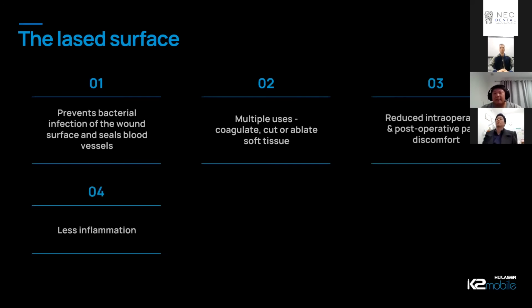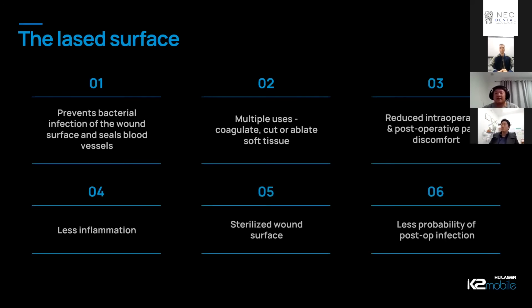So obviously the lasers, like I said, are becoming more popular because of various different reasons. But basically the important thing that I like is that we can have really good hemostatic control. So we don't have to fiddle around with astringent or chemicals or retraction cord or anything like that. It's done, zap, and the bleeding stopped almost immediately. And there's plenty of studies. I mean, like I told you, I'm not an academic, but I've seen plenty of studies that show that wounds actually heal better and faster when using a laser as compared to a traditional scalpel blade. And it reduces the incidence of post-operative infection as well. And similarly, you get decreased swelling and things like that, and scarring.